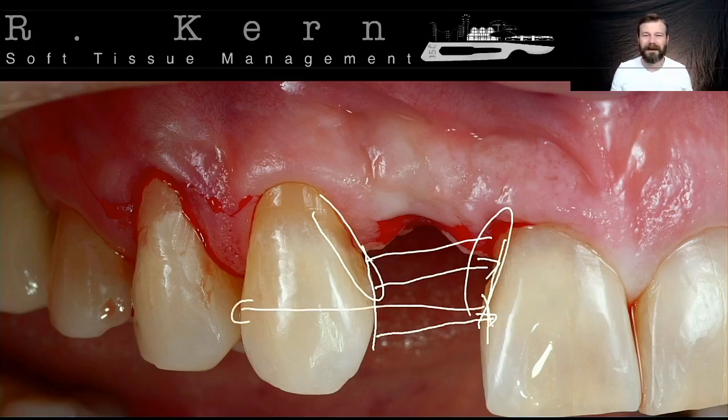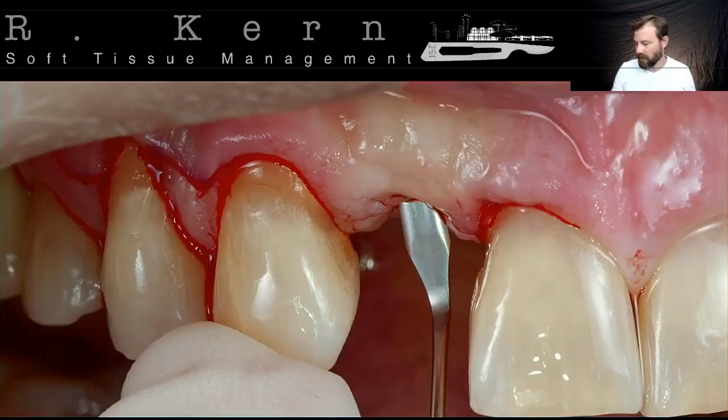So a pedicle is not large for that, but for 1 crown, 1 tooth, the pedicle is perfect. So every time when I can, I'm going to use the pedicle. For that, the defect must fit for this challenge, and the thickness of the palate also must be enough for me to really have this option here.